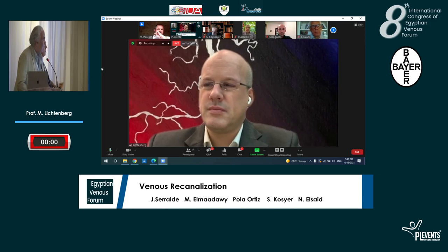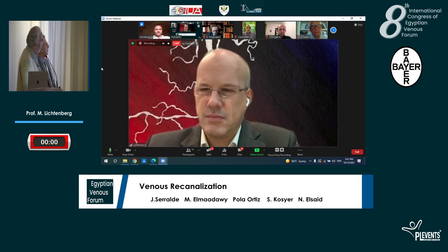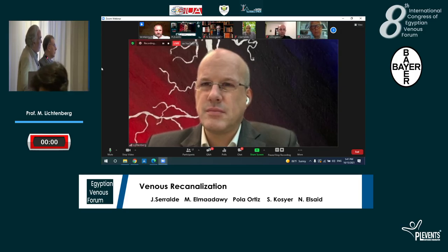Thank you, Dr. Michael. I wonder if you have any comment on this: for the venous system, you transfer volume from the lower limb to the IVC. So it's a volume transfer, not a pressure transfer. Does this point affect the patency of the graft? Because at the beginning we are very happy with our results, but once the limb is released from the high pressure, we start getting complications and we need another recanalization session. What do you say about this?